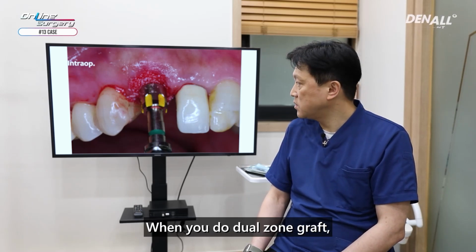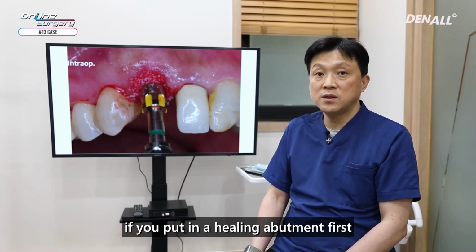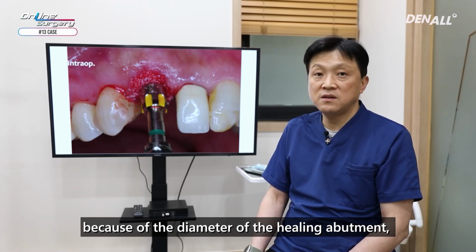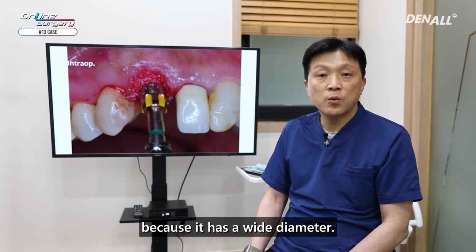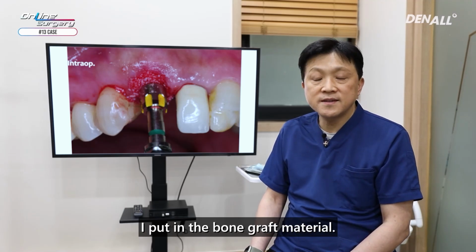When you do dual zone graft, if you put in a healing abutment first, because of the diameter of the healing abutment, then there can be difficulties in putting in graft material because it has a wide diameter. In my case, with the implant driver on, I put in the bone graft material.